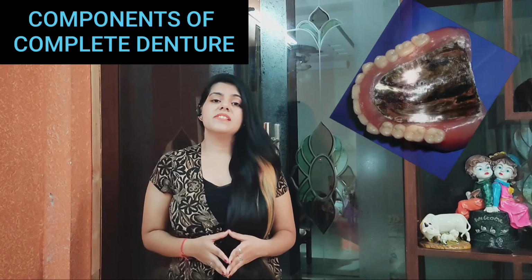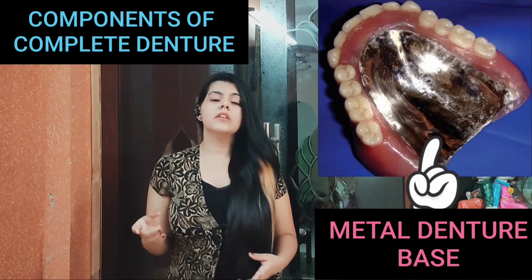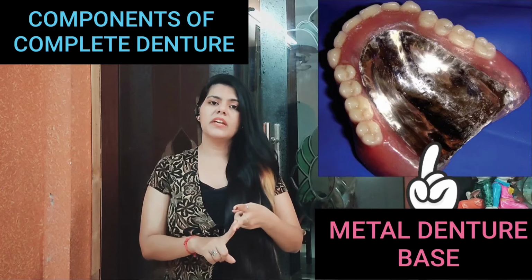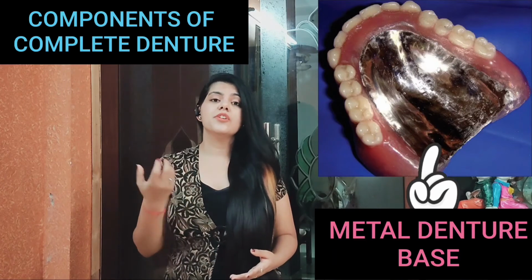Type of denture base is the metal based denture base. The metal denture base is basically fabricated either made up of gold or gold alloys or chromium nickel or cobalt chromium. Any of the materials can be used as a metal denture base.